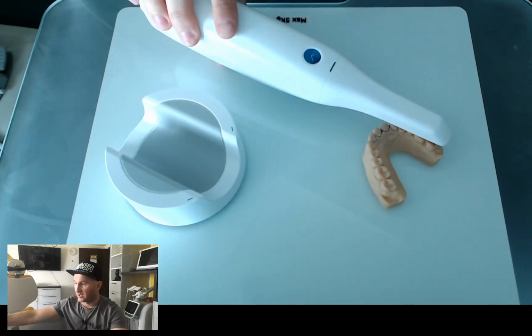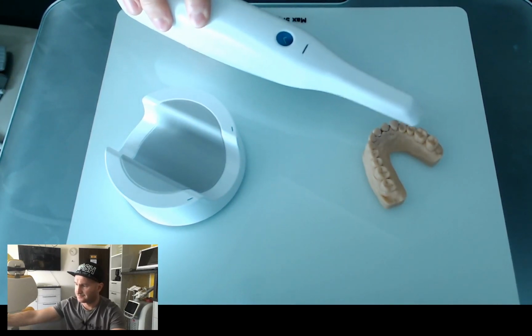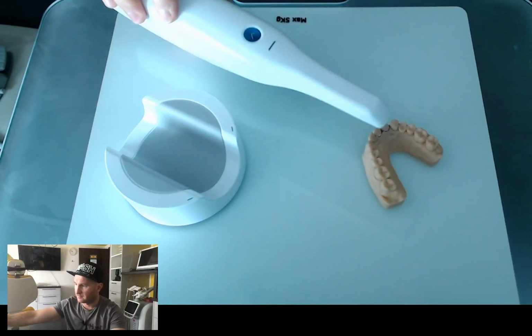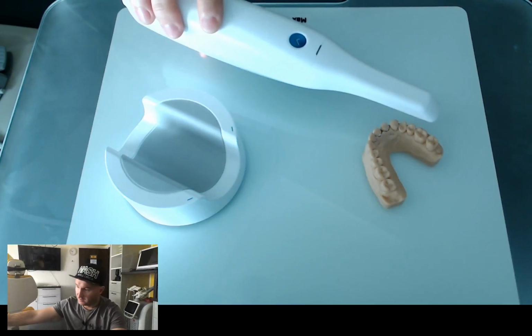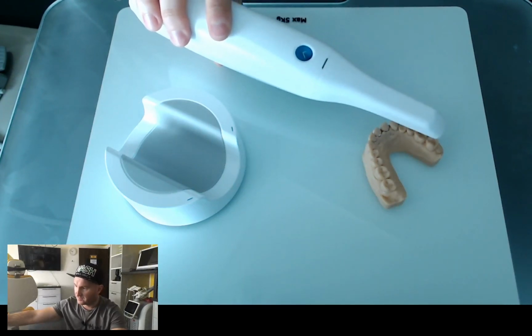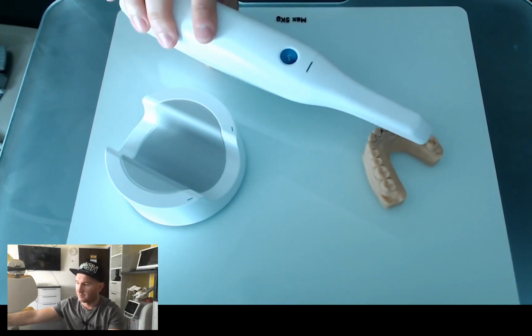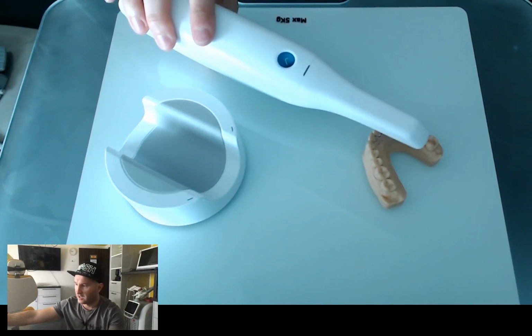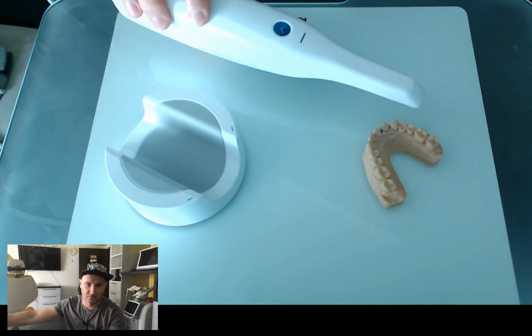Because when you take your impression, you are registering your prosthetic area in one shot, let's call it like this, because you take your impression mass on your tray, you put it in your mouth, and you register the entire teeth at once, on one time.